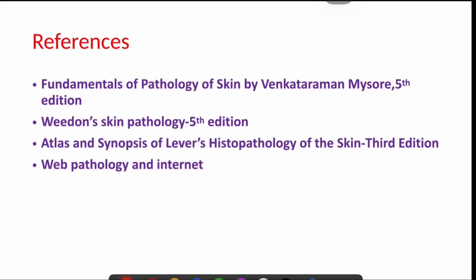So thank you very much. These are my references for skin pattern and skin biopsy interpretation. I hope you will now easily identify your skin microscopy pattern, and you will easily reach a diagnosis.